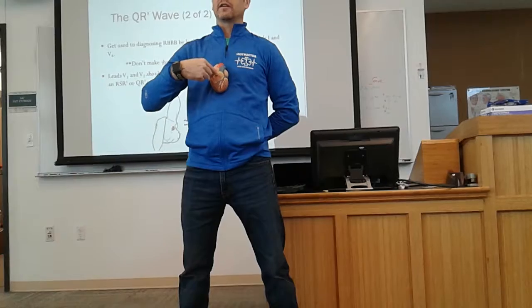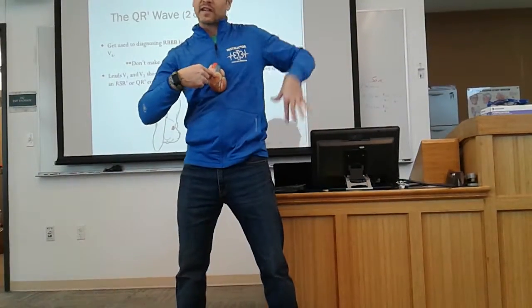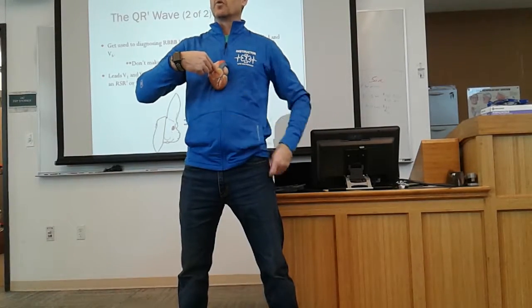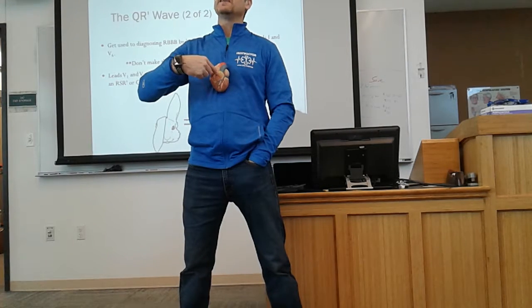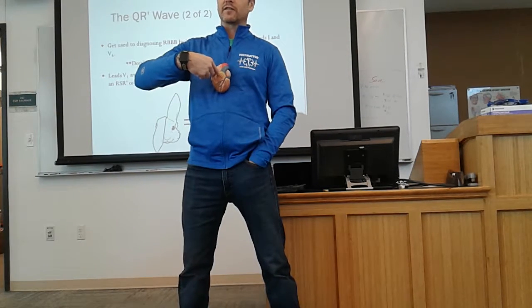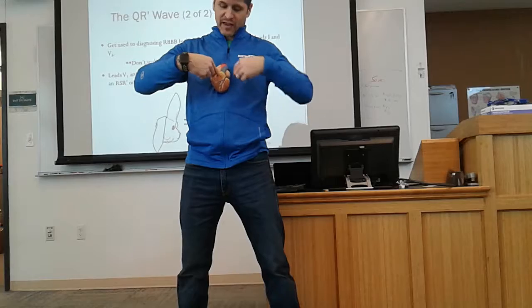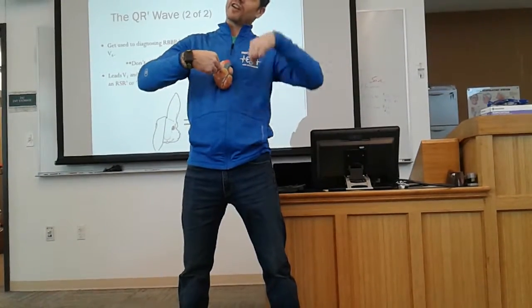The left side is firing this way and posteriorly, primarily. That's the way the left side fires, right? So what's the QRS complex normally going to look like in V1, where my finger is? Smaller. More negative? Yeah, because everything is firing away from it. The majority of my electrical activity is firing away from it.